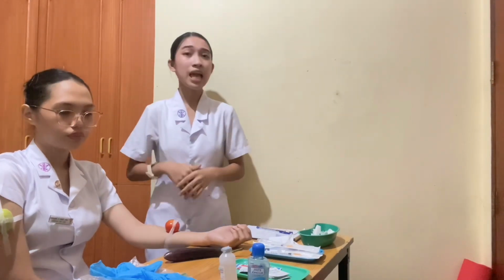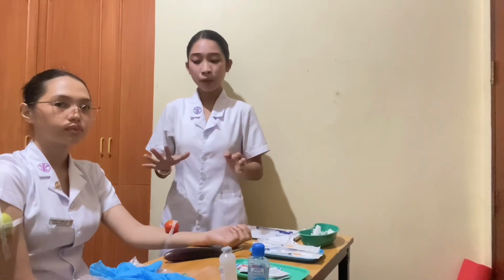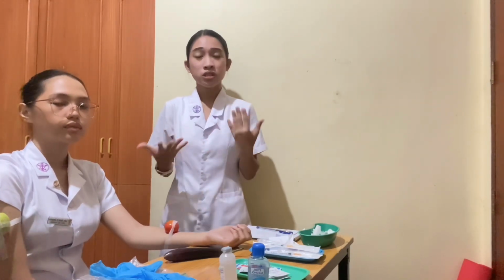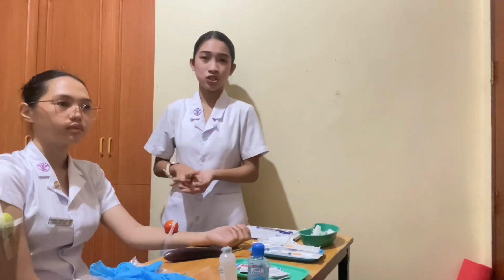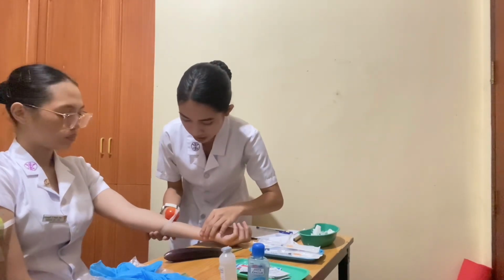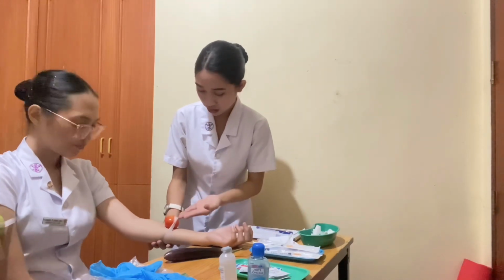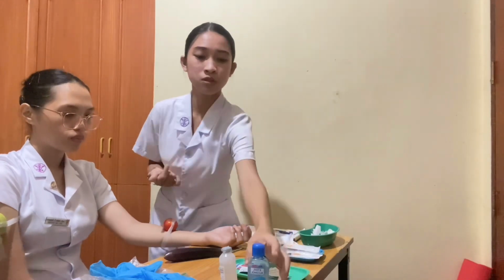Okay? Now assist the patient in a comfortable sitting position and select the site of injection, and remember to select a site that has no tenderness, swelling, or inflammation, or those that have lesions. Okay, ma'am, can I see your hand? This part has no lesion, so is it okay if I inject this part? Okay. After that, we have to wear gloves.